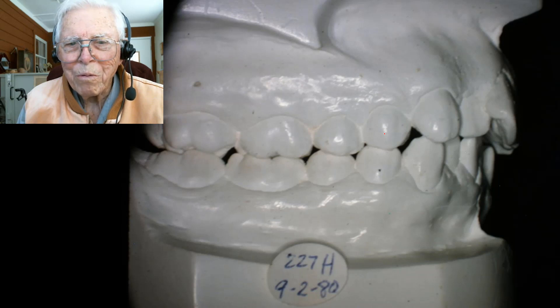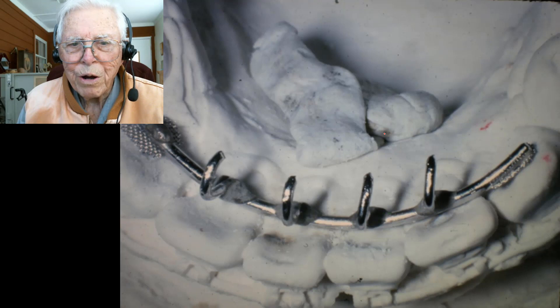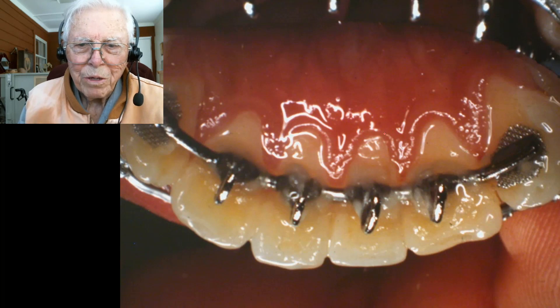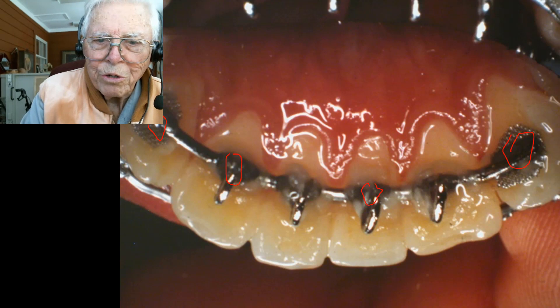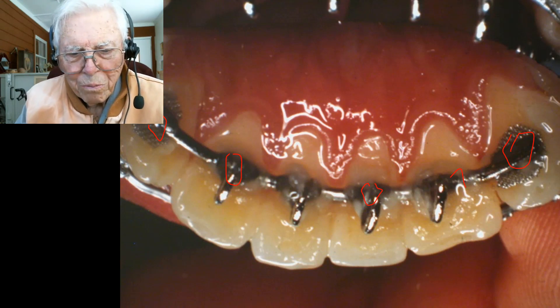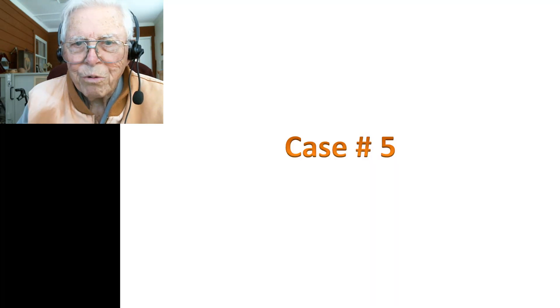We went ahead and finished the case just like we normally would. It had a kind of a class two situation on the right side, and the overjet is way out on one area there, and another tooth is not far. Look at the other side — it's nearly class one, so there's a lot of difference in that respect. We bonded a three-to-three, then spot-welded a pad over here, and came back and bonded the wire to each of these teeth. I wanted to make dead sure that thing didn't come loose in the mouth.